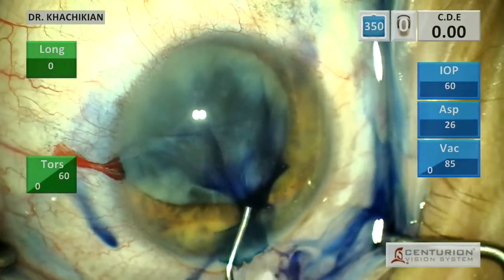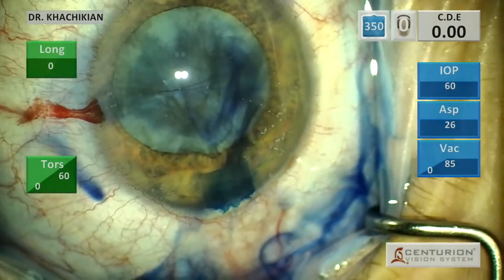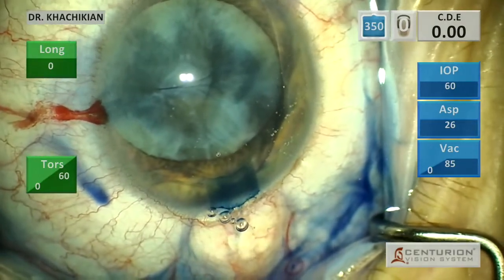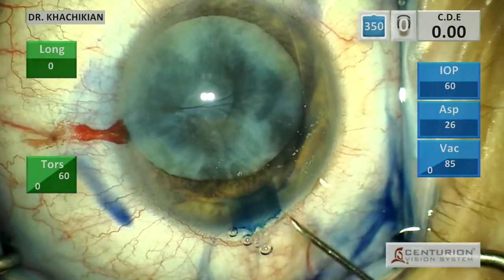We place the TriPan Blue under the capsule, paint the anterior capsule with the TriPan Blue, and then irrigate it out. We re-inflate with viscoelastic, and then you can see there's some denser staining, especially centrally. Then we will begin our capsular rhexis.